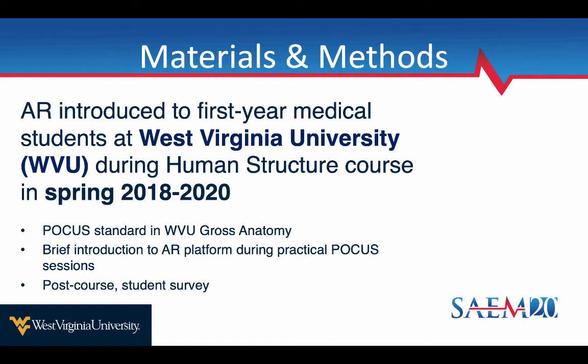So the introduction and formal time was pretty brief, but the hope was to allow them and encourage them to practice with it and gain some more experience in their own time. And then afterwards, we surveyed the students to see mostly attitudinal things about how they felt the technology helped them understand multiplanar anatomy and things like that. We did not do a control group. We didn't want some students to feel like others had an advantage, so that'll be one of the limitations we talk about later.